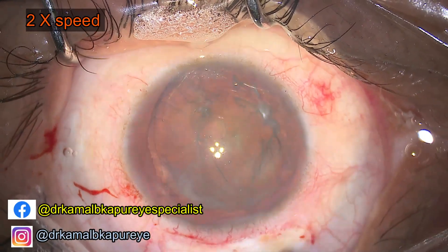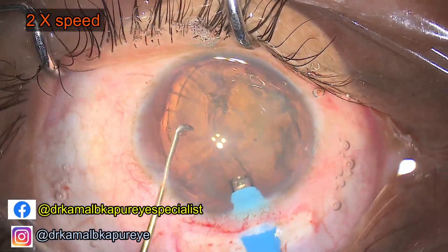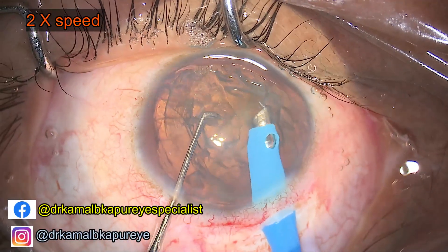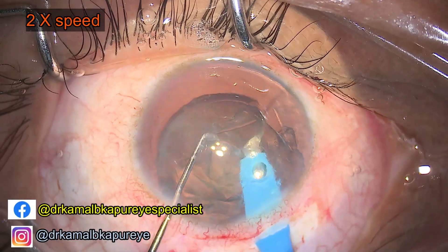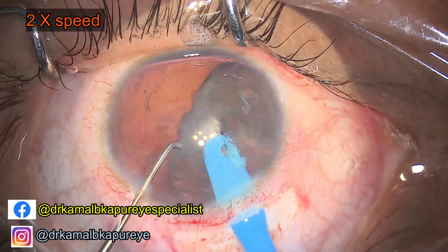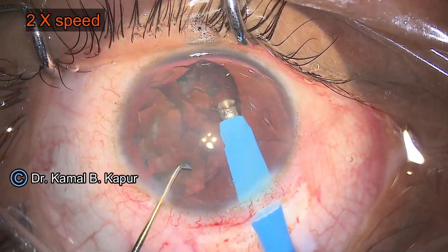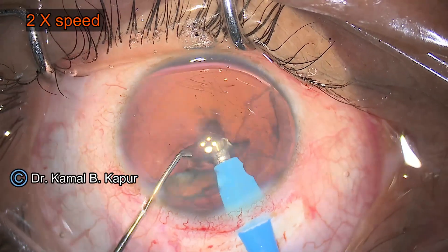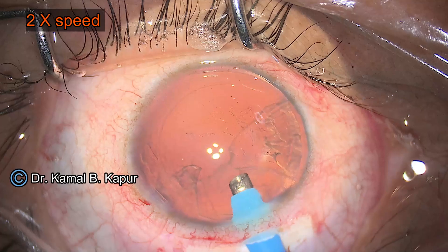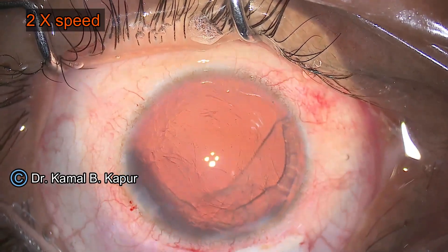We've delivered this soft cataract into the anterior chamber. The delivery is being done with a very moderate amount of phacoemulsification, and since it's a soft cataract, doing it in the anterior chamber is not a big problem. We're fast-forwarding the surgical video here because the relevant part will be the insertion of the iris-painted aniridia lens.